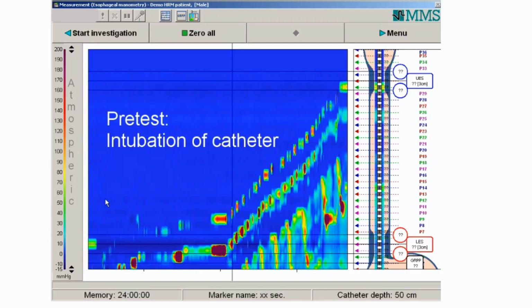before I put it inside the patient, do I do anything before? Do I put some lubricant jelly on it, or can I just go right in?